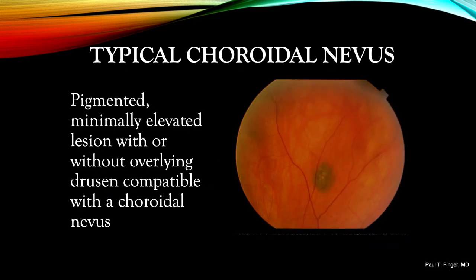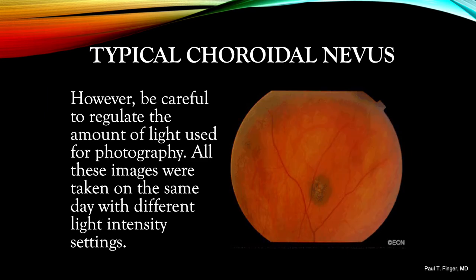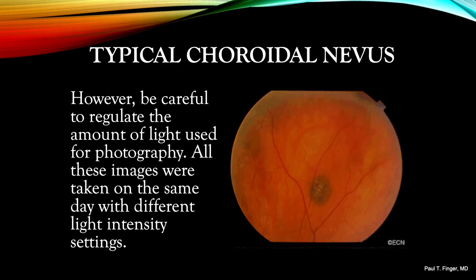Most choroidal nevi are benign and present as minimally elevated, moderately well-circumscribed tumors. This one has a few scattered overlying drusenoid retinal pigment epithelial detachments. However, be careful to photograph all pigmented intraocular tumors with the same amount of light. As you see here, despite all these photographs being taken on the same day, the light intensity appears to change the size. This is particularly important when comparing images to monitor for tumor change over time.